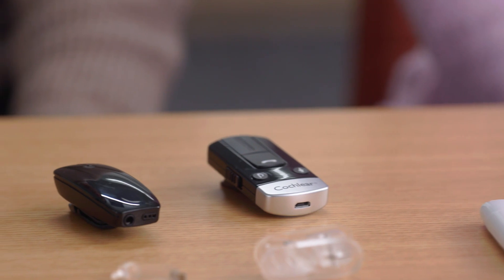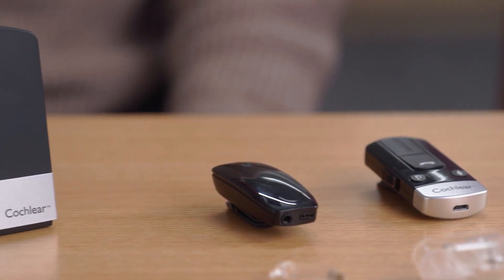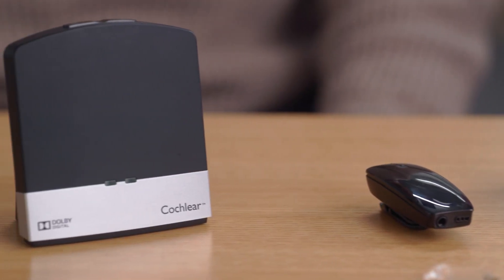Hi everyone, I'm Bethany, an audiologist and Cochlear employee. And I'm Greg, a Bilateral Cochlear Implant recipient and I also work at Cochlear. Today we'd like to share with you what's included in the Cochlear Nucleus 8 Sound Processor Kit. Whether you're a new recipient, have recently upgraded, or are just curious to learn more, this video is perfect for you.